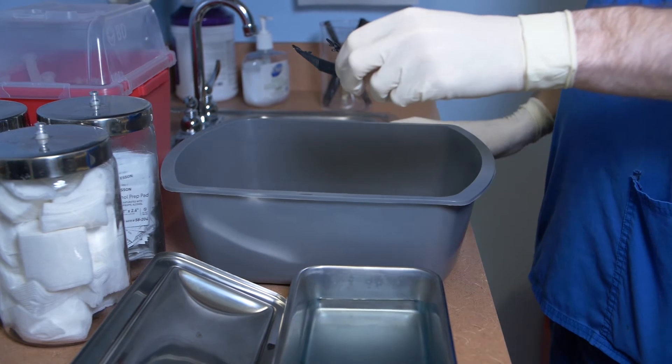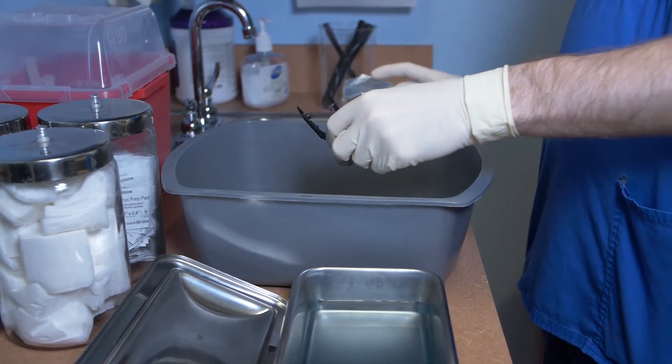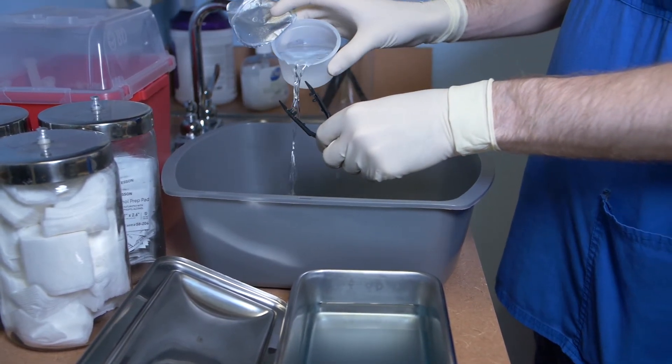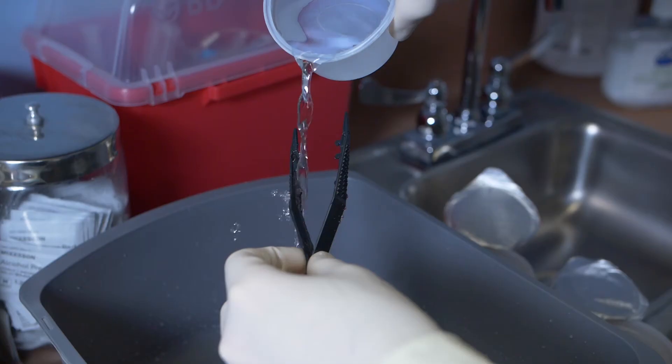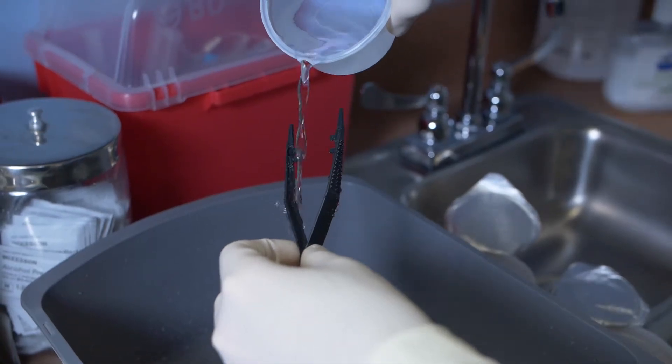Following the recommended processing time, lift the items from the container using sterile gloved hands or sterile transfer forceps. Carefully hold the items above a sterile basin and pour copious amounts of sterile water over and through the items until they are completely rinsed of the chemical solution. Hold the items upright for a few seconds to allow the excess sterile water to drip off.